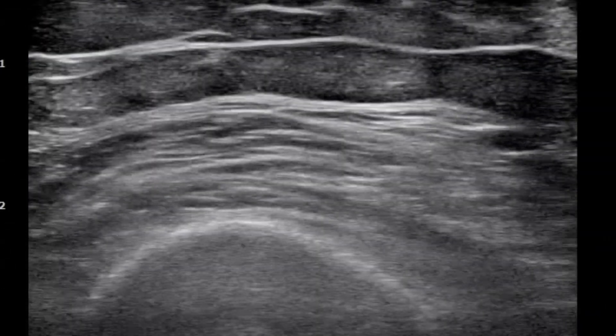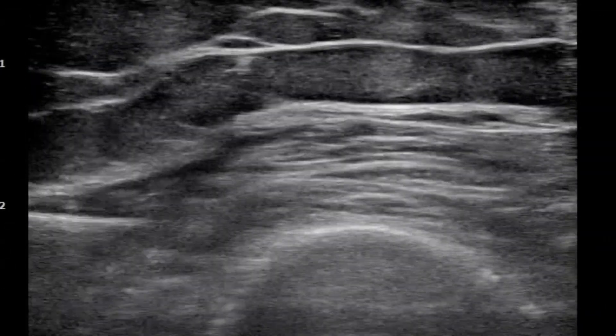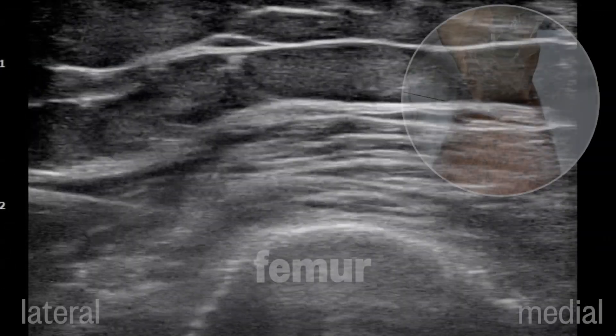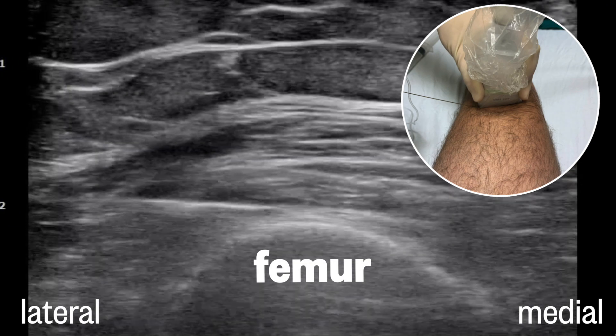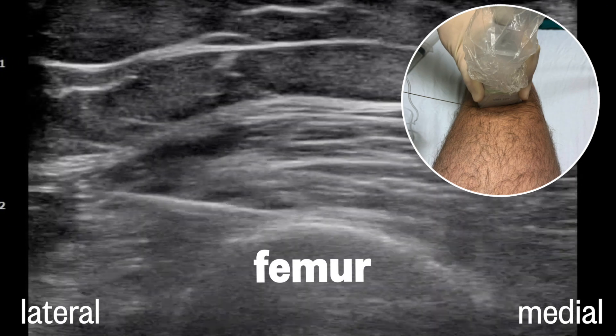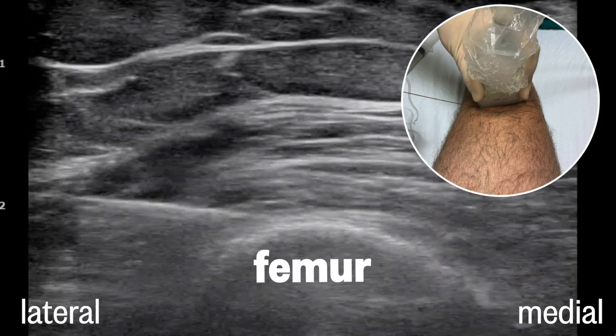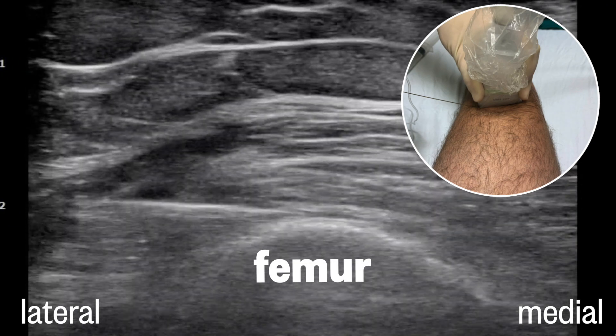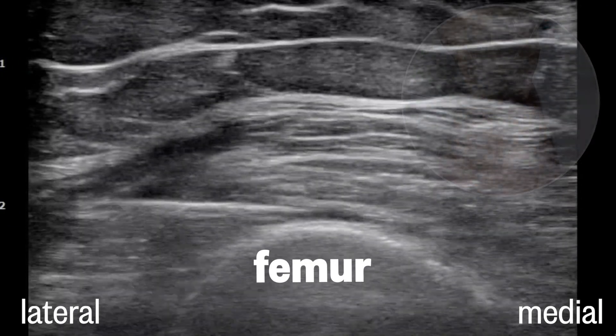Here's the block for the nerve to vastus intermedius. The probe is transverse, a few finger breadths above the patella, and five mils of local is placed on the femoral shaft right at 12 o'clock.